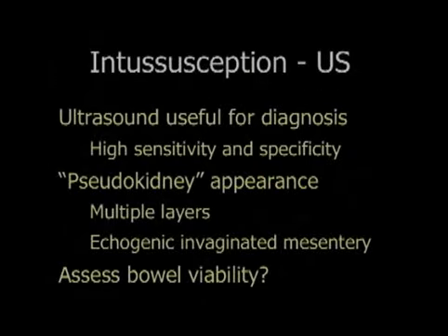Now, while plain films are still rather useful, ultrasound has terribly high sensitivity and specificity for intussusception. It's probably as close to the perfect test as anything we have in pediatric ultrasound.